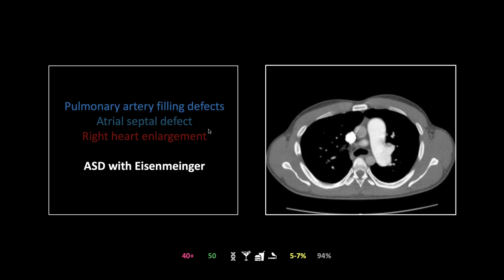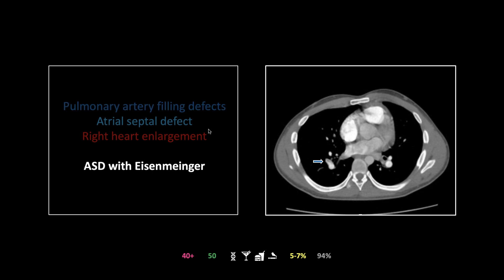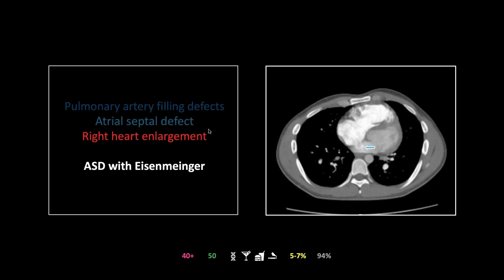There are pulmonary arterial filling defects — one in the left pulmonary artery, which is enlarged, and one in the right. There is a large atrial septal defect with right-to-left shunting, and right heart enlargement related to chronic left-to-right shunting. This is an ASD with Eisenmenger syndrome: the patient had a pulmonary embolism that increased right-sided pressures and caused right-to-left shunting across the ASD — pretty unusual to catch on CT.